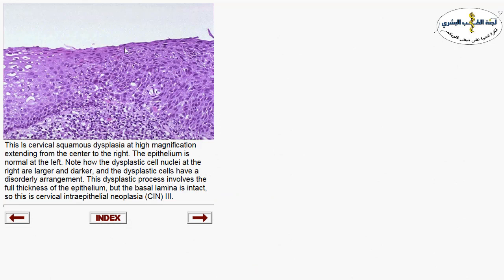In severe dysplasia, comparing the left and right sides, you can see how the nuclei and cells have lost their polarity, not respecting each other, with hyperchromasia reaching up to the surface. This is full thickness dysplasia — CIN grade three. However, the basement membrane remains intact; there is no breaching of dysplastic cells beneath the epithelium or invasion of the stroma. So this is CIN 3 in situ with no invasive component.